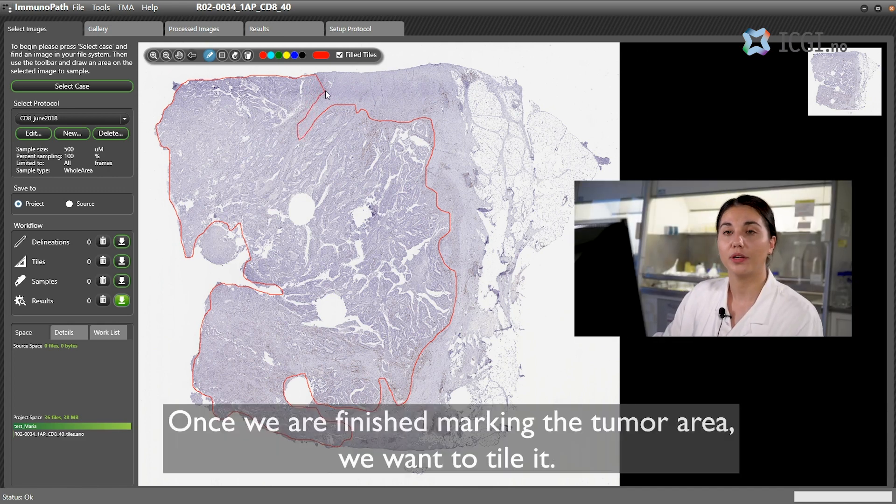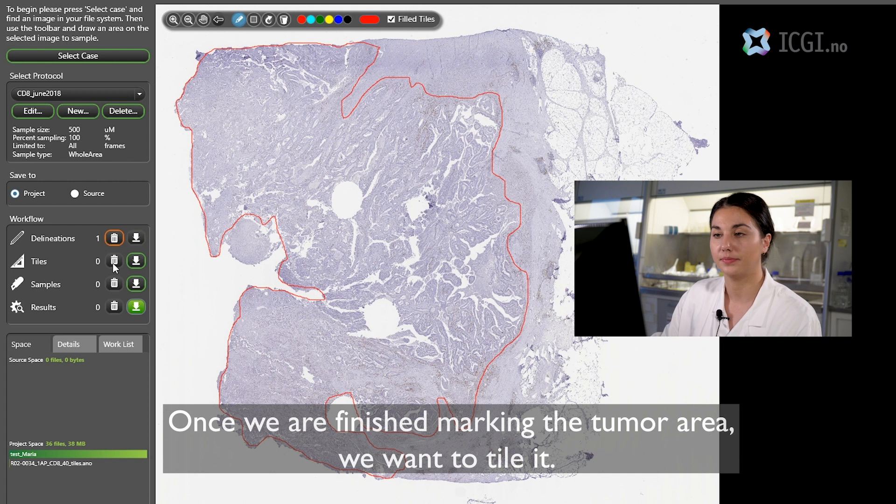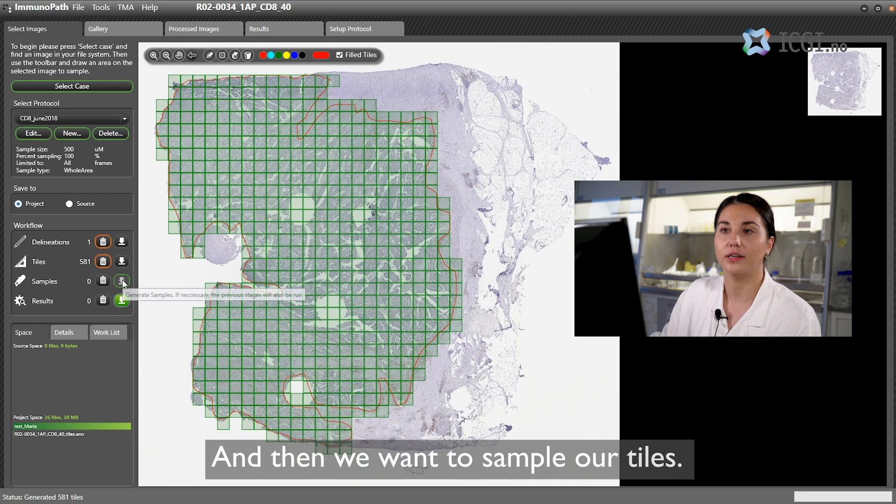Once we are finished marking the tumor area we want to tile it. Do that by pressing tiles. And then we want to sample our tiles.